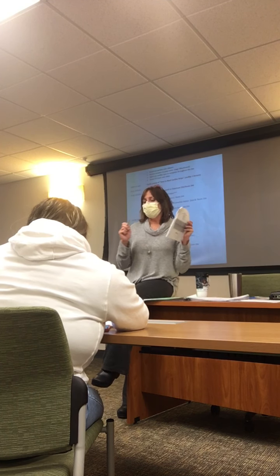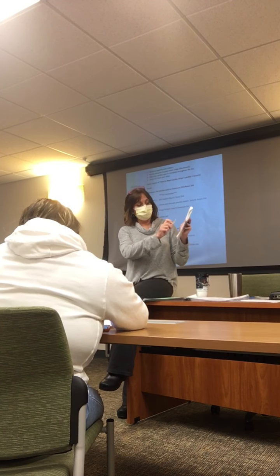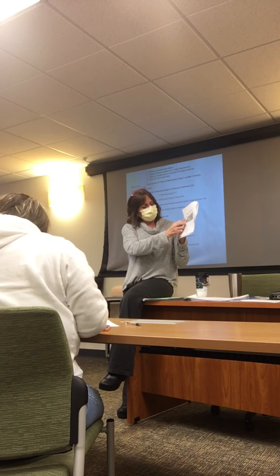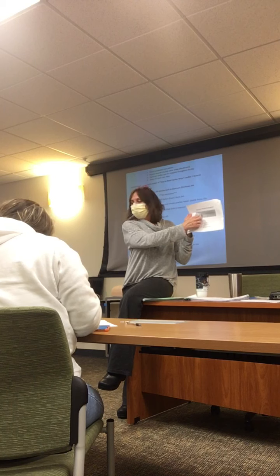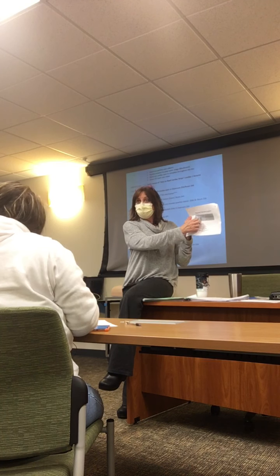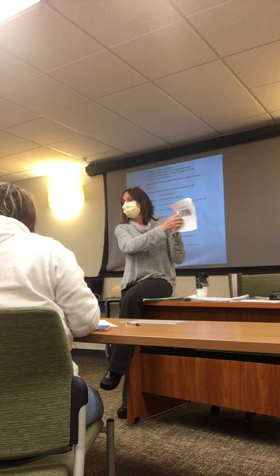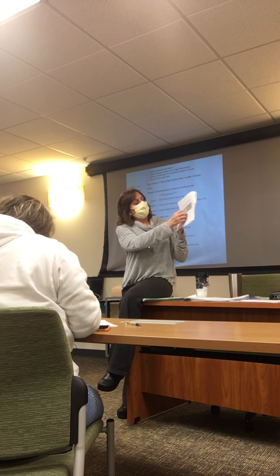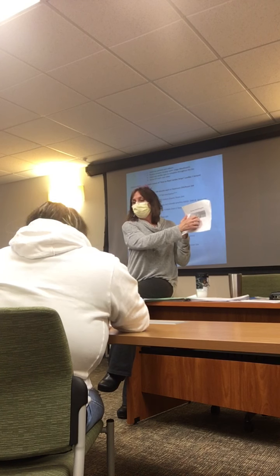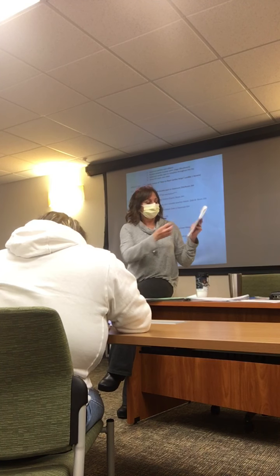This is where we can tell if we're having different ectopic beats. So I get my calipers, and here it's regular. This beat here, is it early or late? It's early. It comes early. In the cardiac world, anything that's early is called premature. So it's regular here, but this is another early or premature beat.